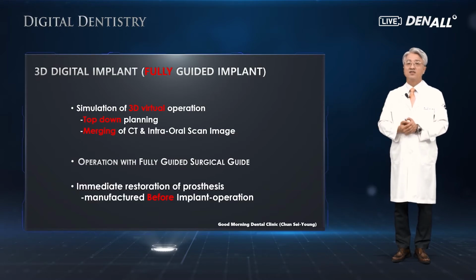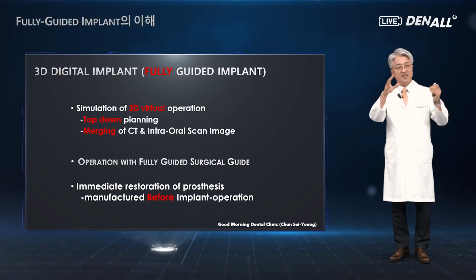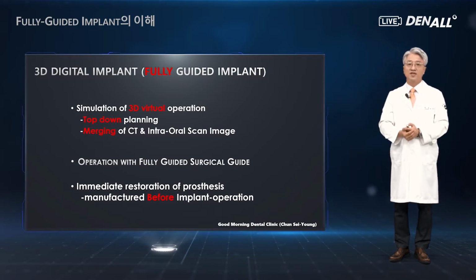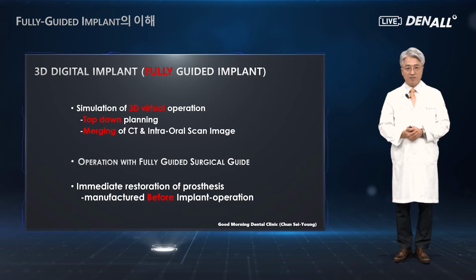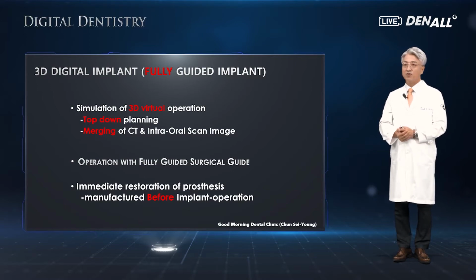And lastly, as I explained before, implant is placed in a patient, pre-designed data is used to prefabricate prosthesis, temporary or abutment to do immediate placement.